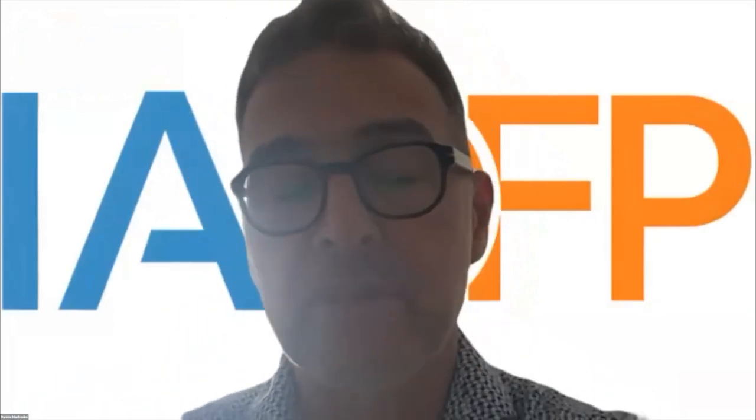I don't know if Danielle or some of our colleagues on the board have another view. No, Ghabi, I think that we can all agree on this perspective. There are situations that you can manage pretty easily without prescribing an MRI, and others, of course.